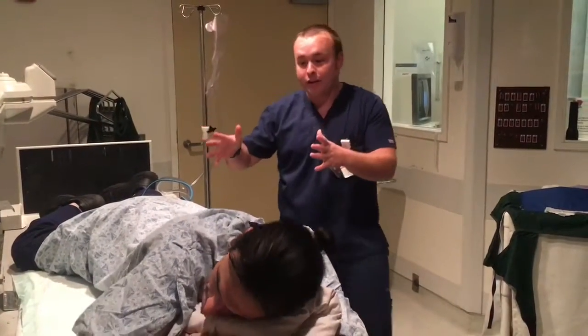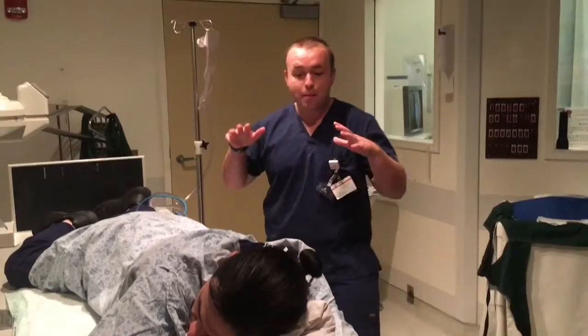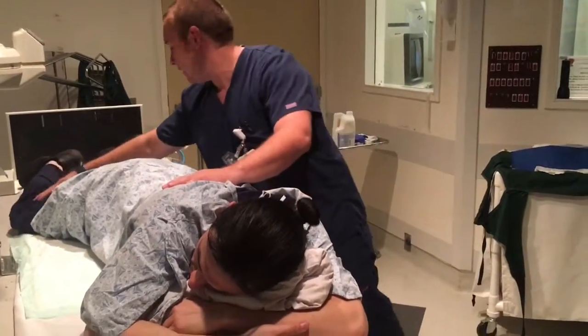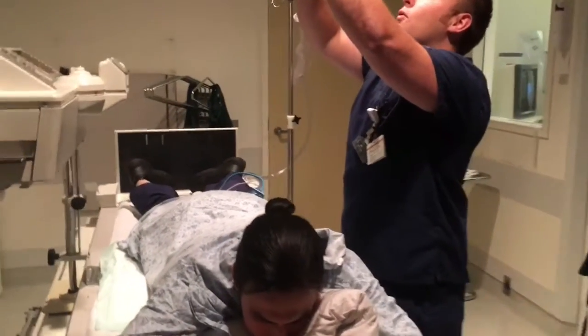Alright, so the doc just left. He just finished his fluoroscopy. I'm going to do my overhead pictures. We've got about 7 or 8 pictures to do. I'm going to start off with the PA. Patient's going to be totally prone, so go ahead and straighten out this leg, just nice and flat. Alright, I'm going to do an SID of 40.